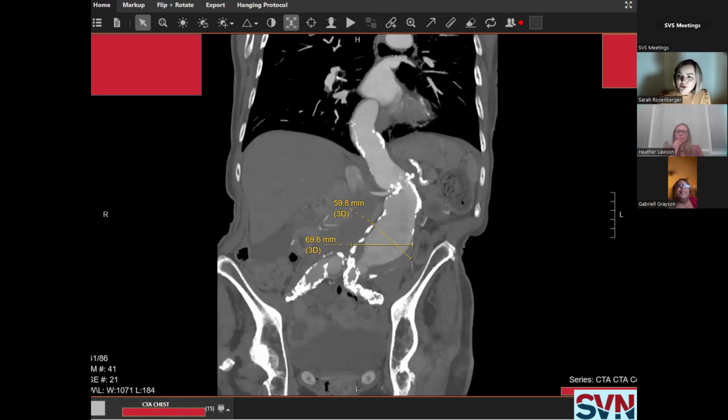And the risk of rupture for an 11 centimeter aneurysm is a heck of a lot higher than a 6 centimeter aneurysm. And it creates a sense of panic or urgency, not only for the patient, but for non-experts. So the length measurement is really unhelpful. And if you have uneven measurements, you should take advantage of those reconstructions in the coronal or sagittal planes to get more accurate measurements.